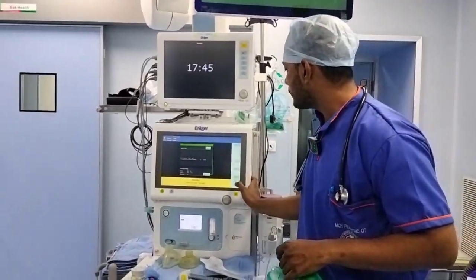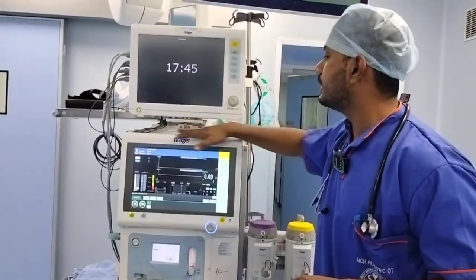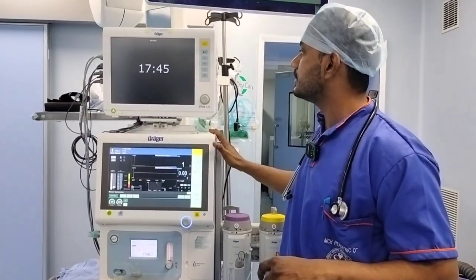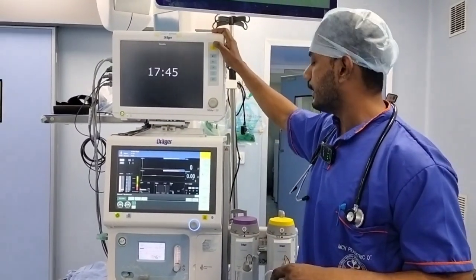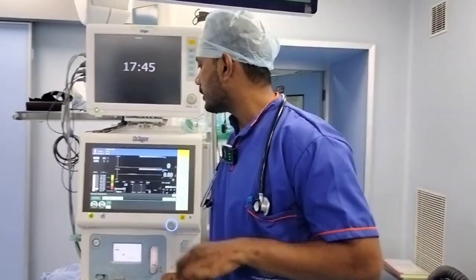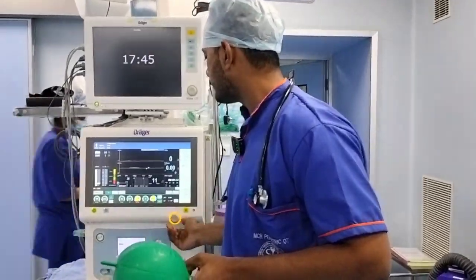This is actually not exactly a ventilator. This is a ventilator, but the setup as a whole is what we call an anesthesia workstation. This is a monitor which I have shown. These are vaporizers, and it has many other components. Right now we will just see the functions of the ventilator.